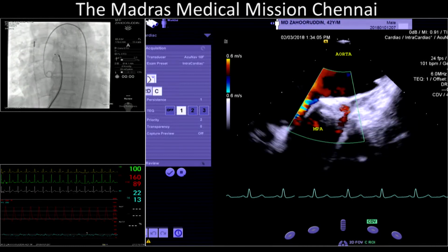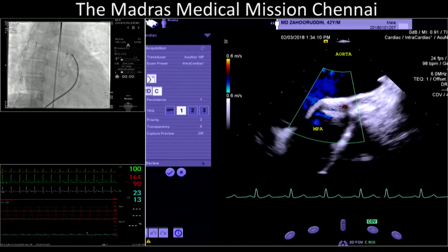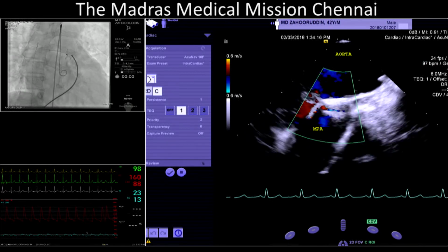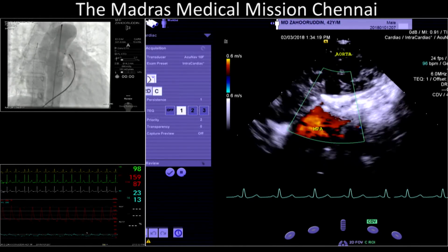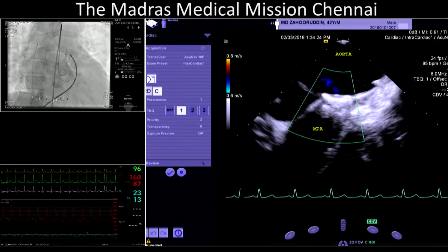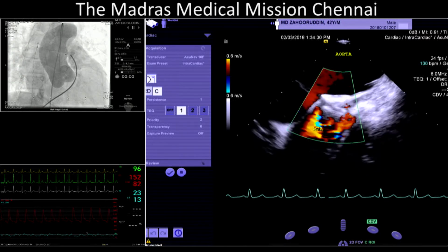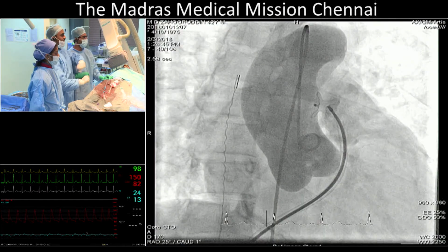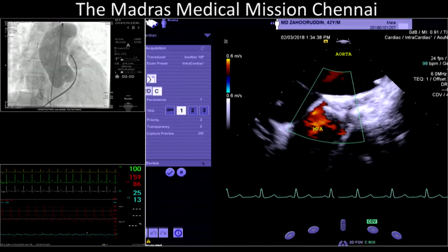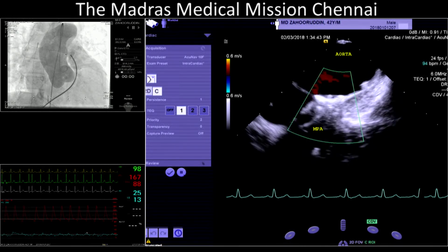Yes. Come towards the AP view. My question was... Come more. Enough. Do you apply contrast? Yeah. That's a wonderful position now. Shall I shoot? It looks good. So freeze the frame where it was shown best. Wonderful. Enough. In fact, Dr. Dietmar, intracardiac echo is better. Show the intracardiac echo. Yeah. Echo big. It looks like a closed PDA shunt, but not on the PDA, but on the window side.